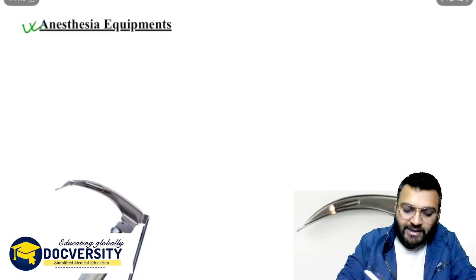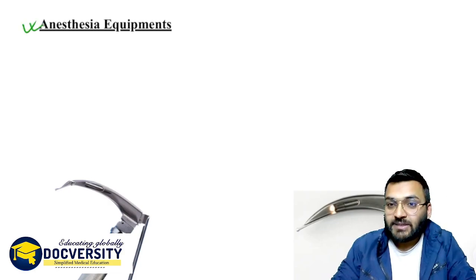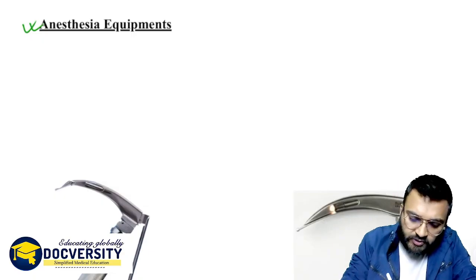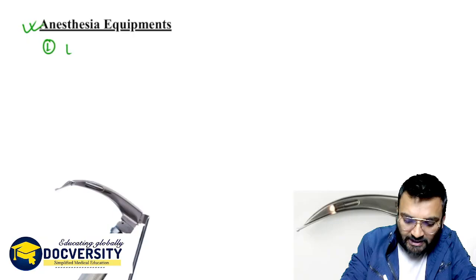Okay, so next we are discussing the anesthesia equipment. Very important. From this anesthesia equipment, FMG mostly asks image-based questions, and sometimes they will ask about the laryngoscope. So what we are discussing here is the laryngoscope.